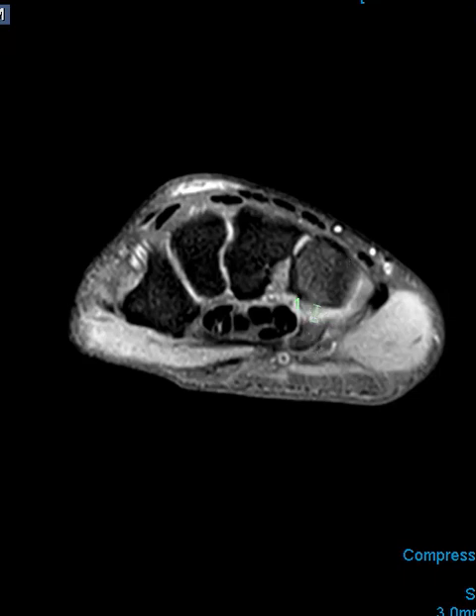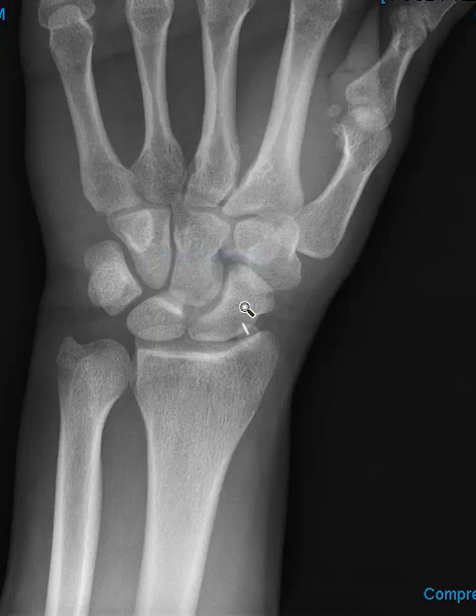So again, this is how to do an arthrogram of the wrist prior to MRI. Thank you so much.